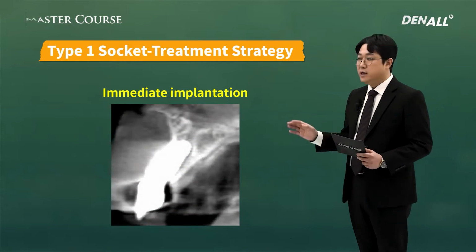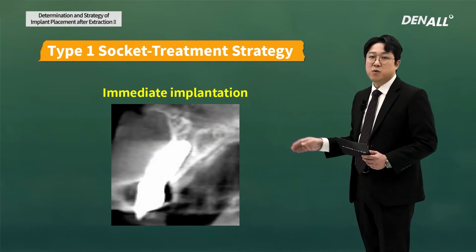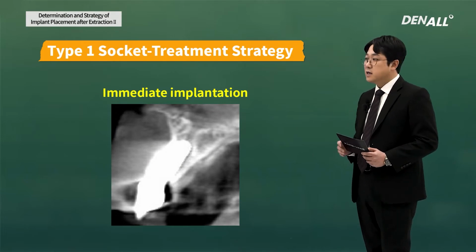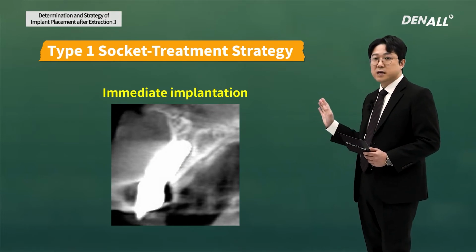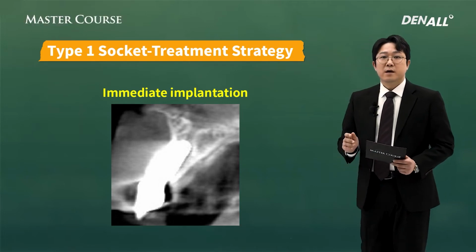This is the CT after completion. Compared with the day of placement, buccally there's a little bit of resorption, but there's still 2 millimeters of buccal bone for implant support.